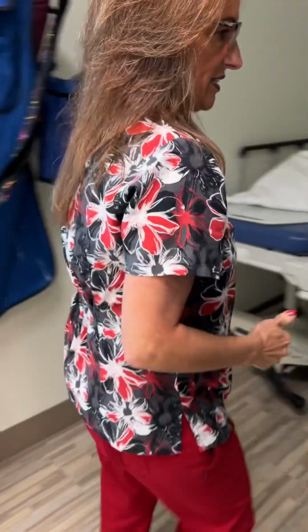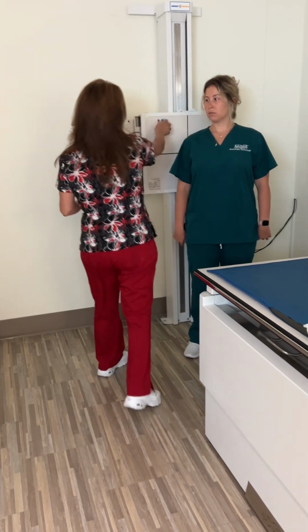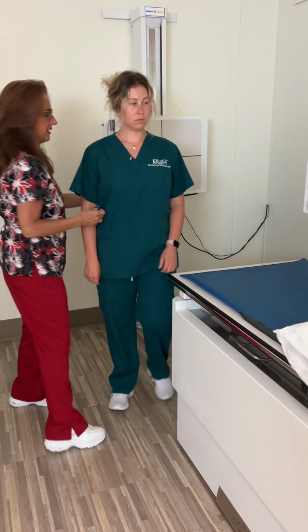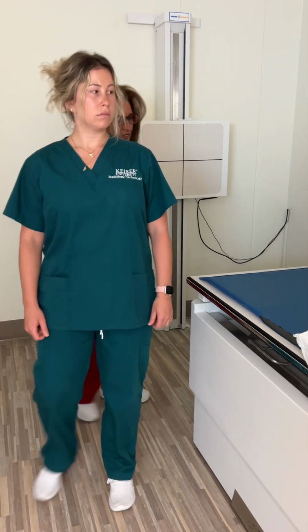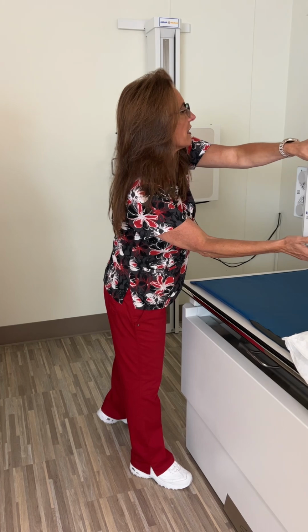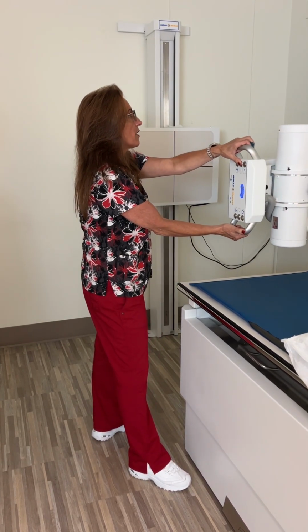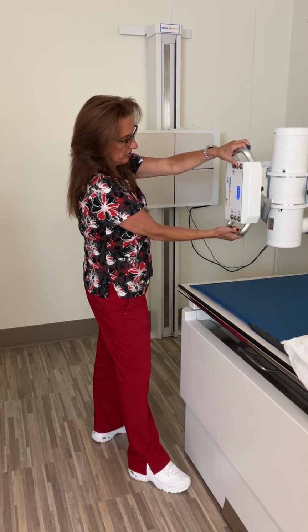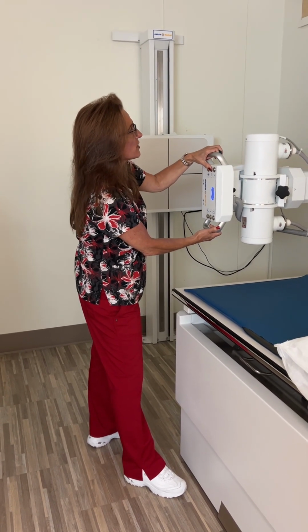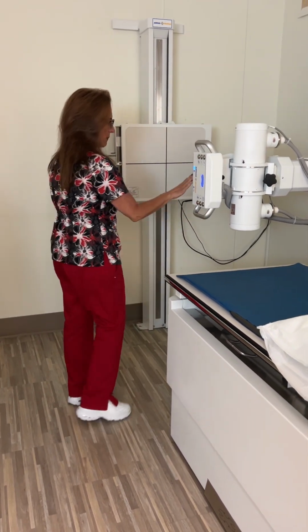You notice that I didn't shield on the PA chest, and that is because typically where we are, shielding is kind of gone away. They found that according to the AAPM report, shielding actually does more harm than good. So we have not been shielding in Florida, I feel like, for quite some time. So that's why you'll notice in these videos there is no shielding taking place.